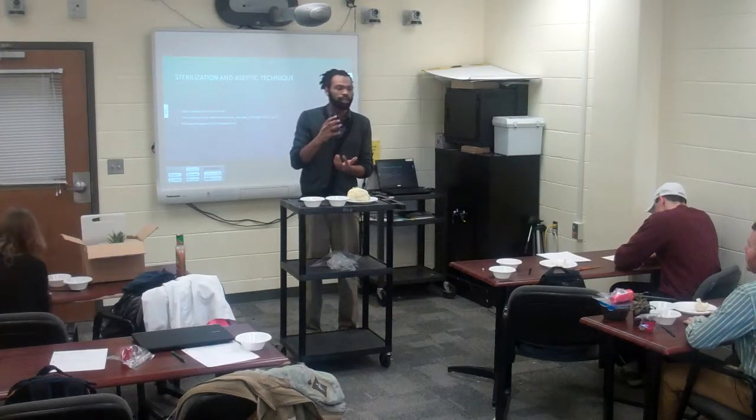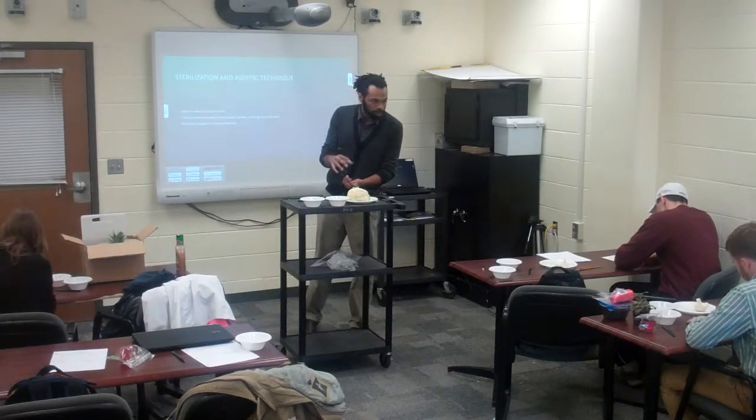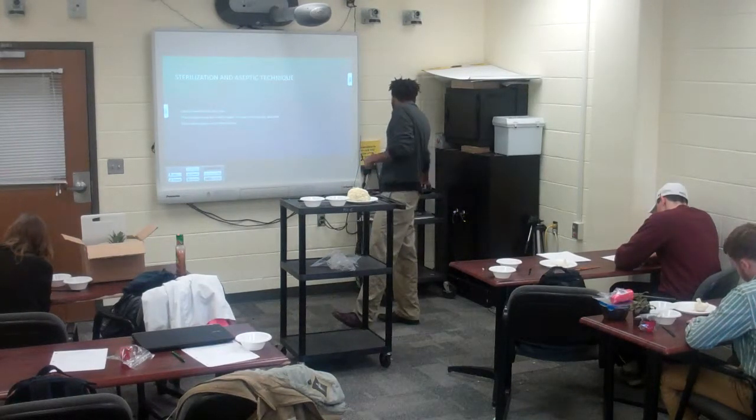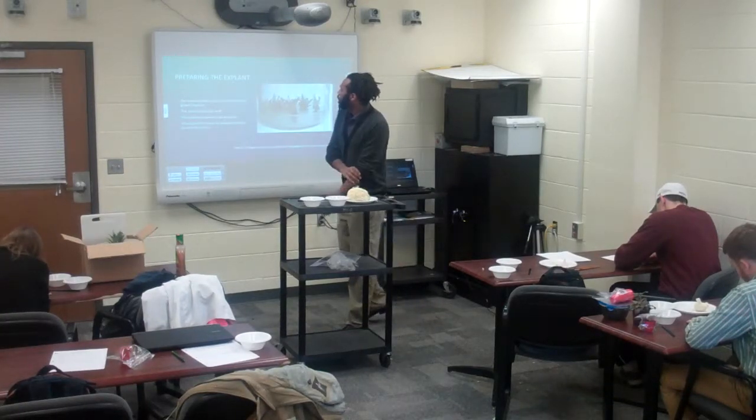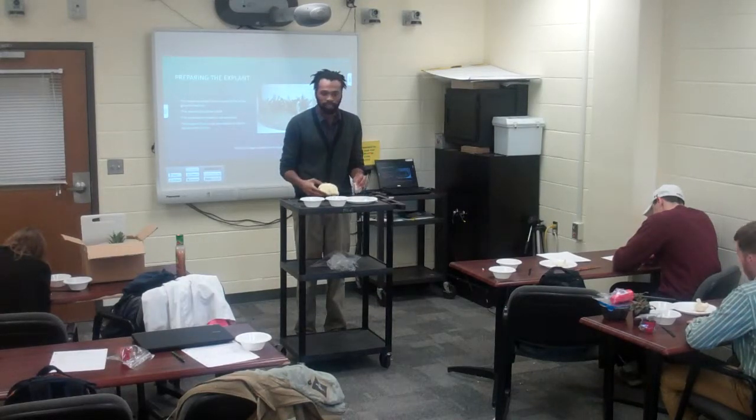That's where the fungal contaminants really get into there. So you want to keep that covered as much as possible, keep the air pollution down, and that'll really keep your experiments running well. And so preparing the explant, this is where we're going to start doing some things for real.